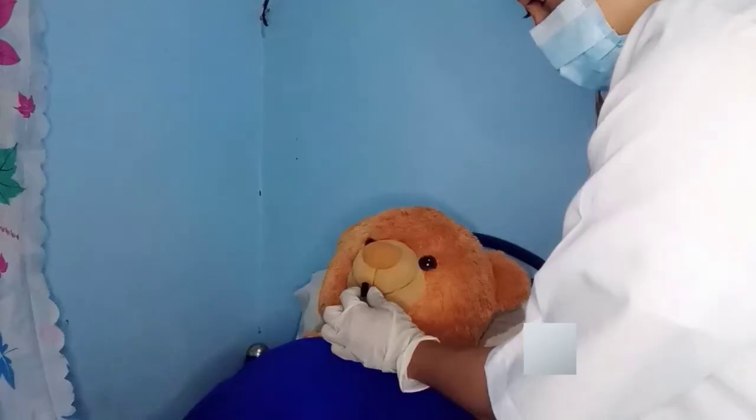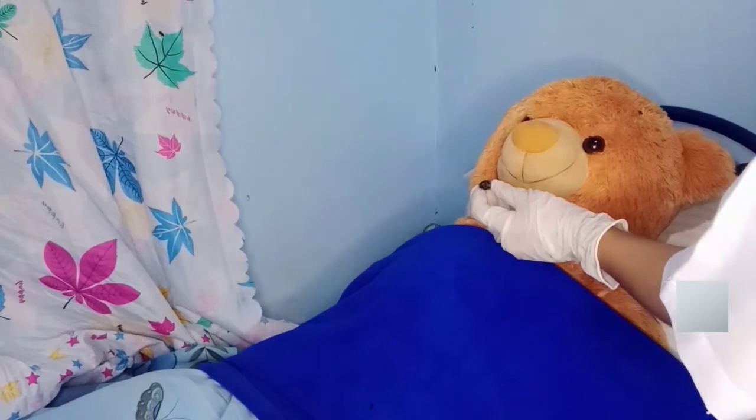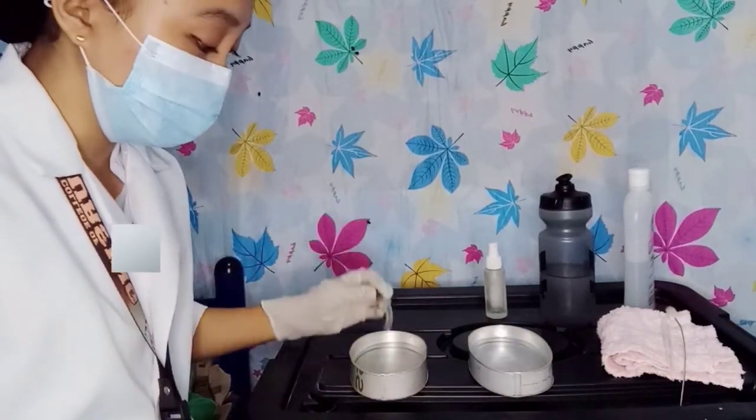First, we need to remove the oxygen source if one is present. Stabilize the outer cannula and faceplate of the tracheostomy with your non-dominant hand. Next, grab the locking mechanism of the inner cannula with your dominant hand, press the tabs, and it is unlocked. Gently remove the inner cannula and place it in the first basin with PNSS plus H2O2. Let it submerge there for a few minutes. Sir, I am going to remove your inner cannula now.